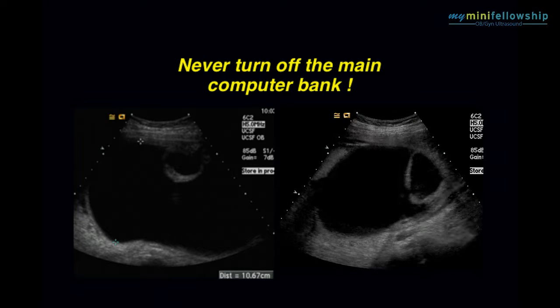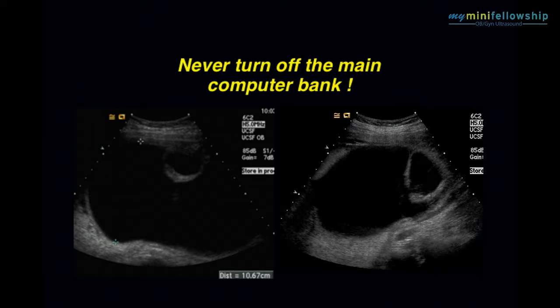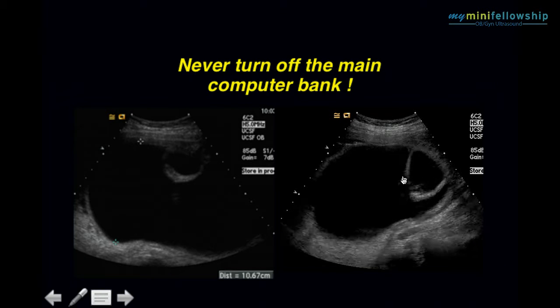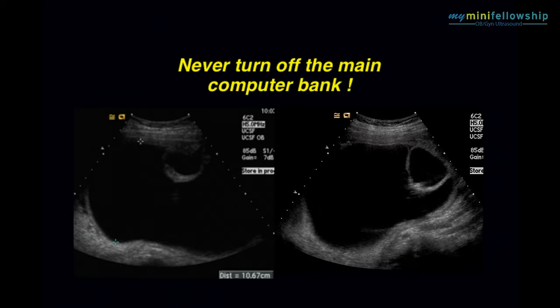Here's another somewhat similar case where if you measure the pocket diameter, you'd say, oh, polyhydramnios. But in fact, all of this fluid is inside of the fetus. Absolutely none of it is in the amniotic cavity. The reason it got there is because this urinary bladder overdistended and ruptured right at that point, producing a massive amount of urine ascites. So none of this is amniotic fluid. Virtually all of it is urine ascites, and this is also a case of profound oligohydramnios.